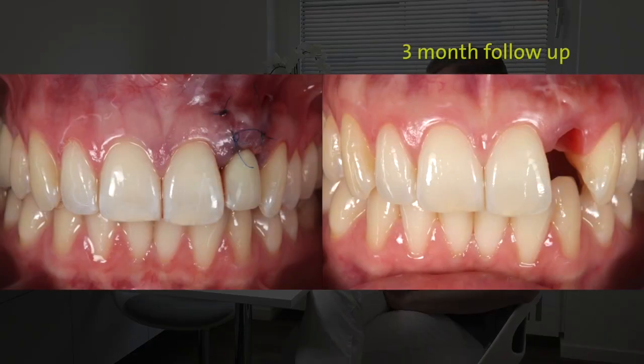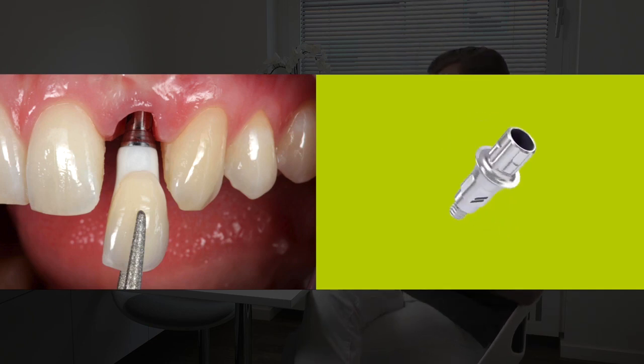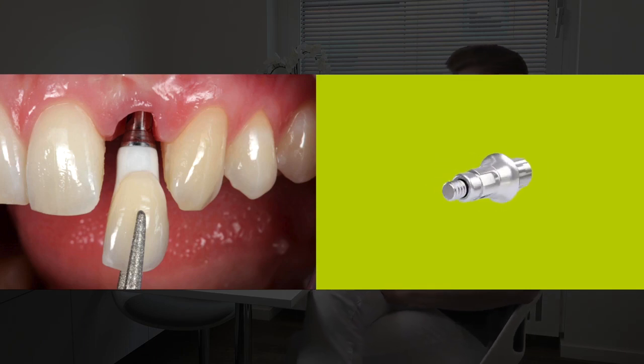On the right picture you see the healing after three months, and this was the day when we took the impression of the implant — you can see nice healing. We fabricated a crown: it's a zirconia framework that we bonded on a titanium base, and of course we have the dental veneering porcelain.